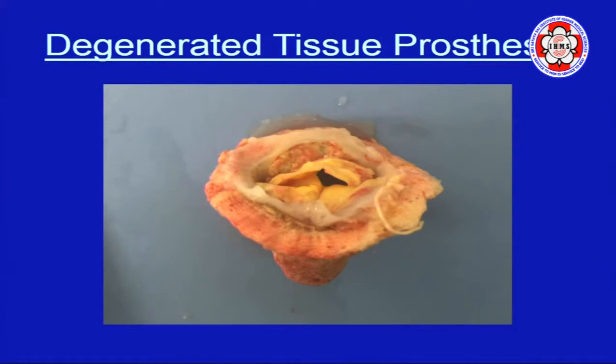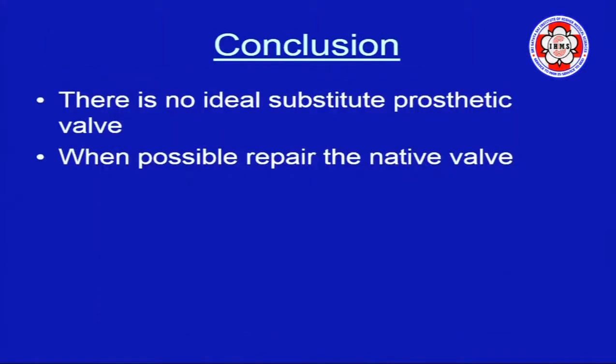This is one of my degenerated prosthetic valves, tissue valves. But again, don't take it as gospel. So there's no ideal substitute prosthetic valve in the market. When possible, repair the native valve.